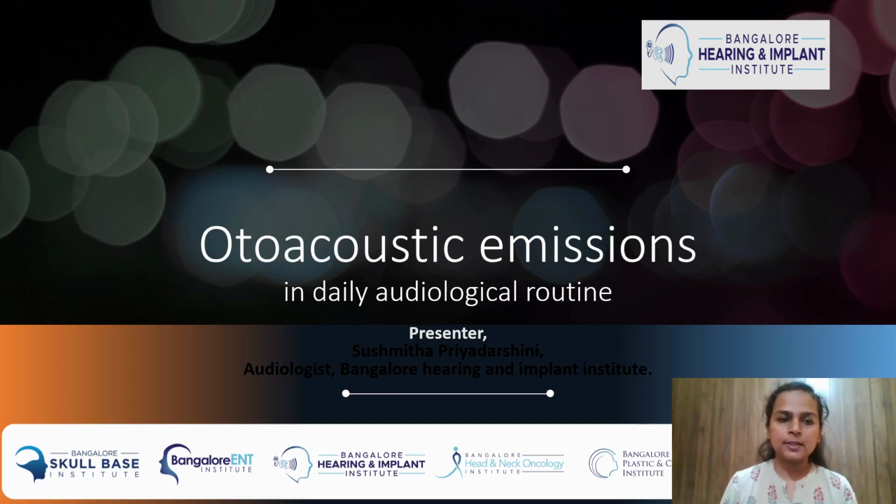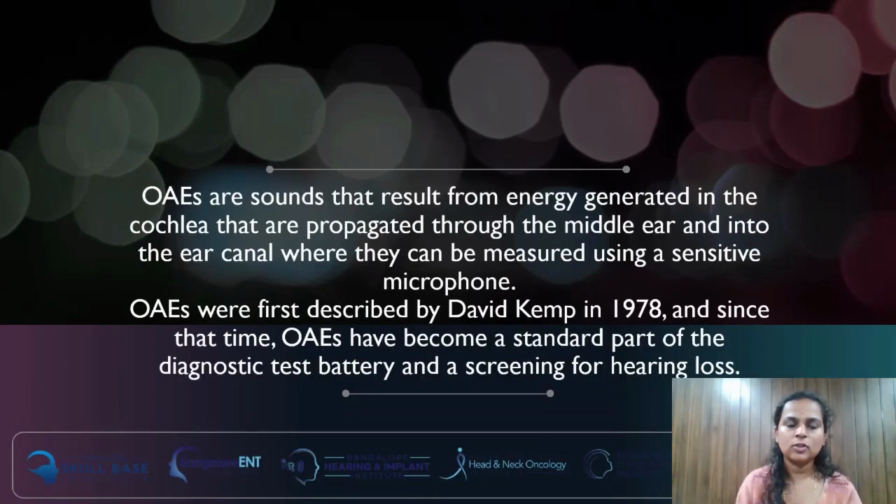My today's presentation is Otoacoustic Emissions in Daily Audiological Routine. Otoacoustic emission is an electrophysiological test that records outer hair cell functions. Otoacoustic emissions are sounds that result from energy generated in the cochlea that are propagated through the middle ear and into the ear canal, where they can be measured using a sensitive microphone.